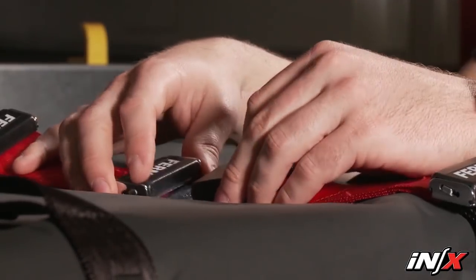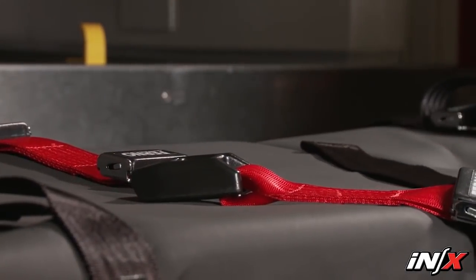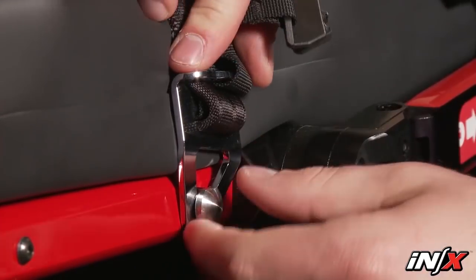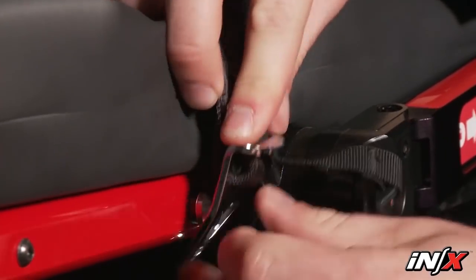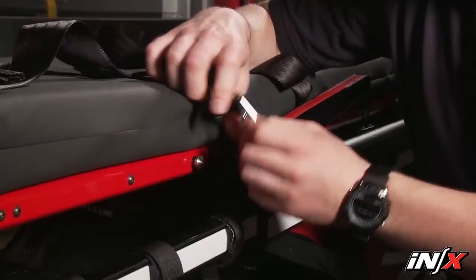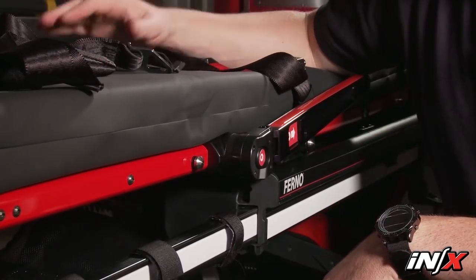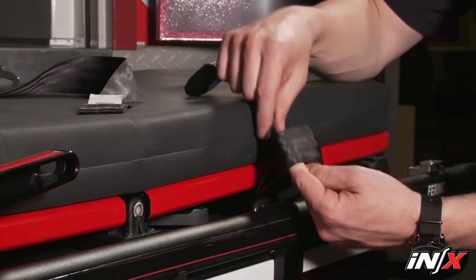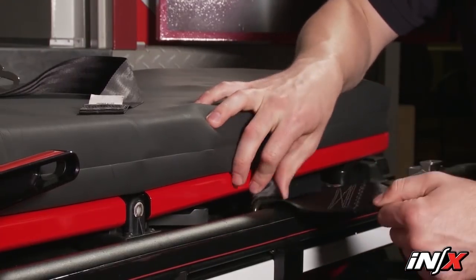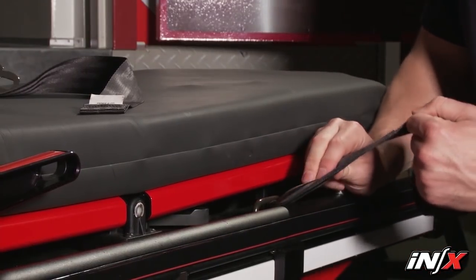Each strap of the leg restraint has a loop. To attach the leg restraint, guide the loop through the restraint bracket on the NX, then insert the buckle or tang through the loop. Pull the strap tight against the restraint bracket. To remove the restraints from the NX, first unbuckle them. Use the pull loop to pull the retaining plugs out of the brackets, then press the restraint brackets down toward the mainframe to unseat them from the posts and remove the restraint brackets from the NX mounted post. To remove the leg restraint, feed the buckle or tang through the loop, then remove the loop from the NX mounted bracket.